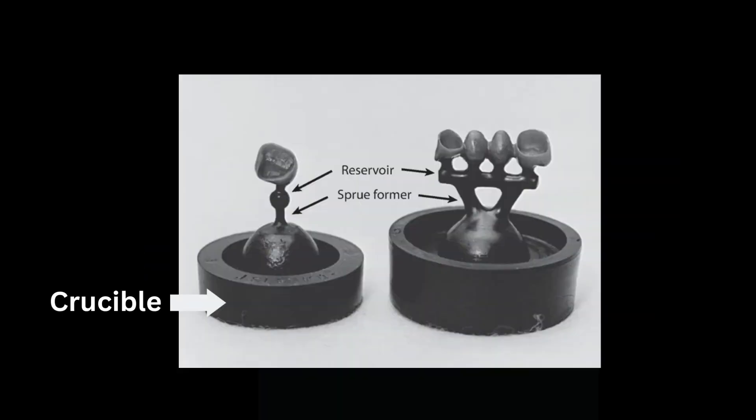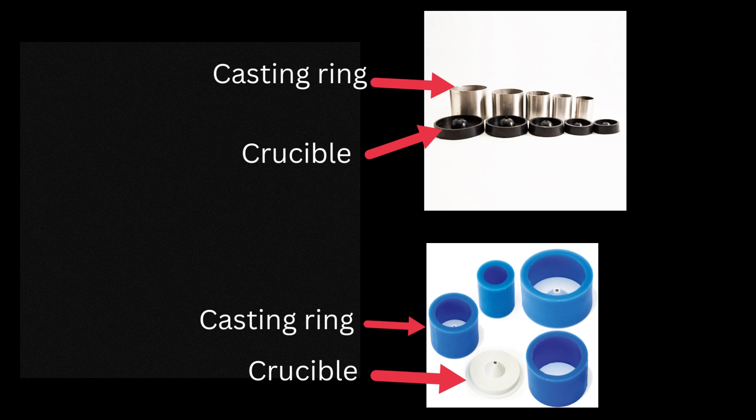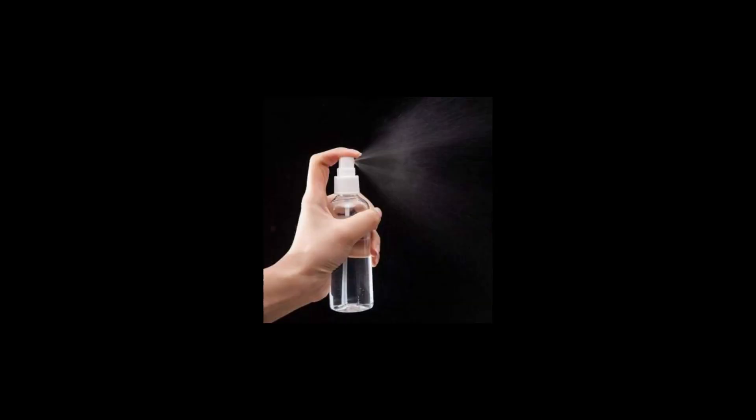The next step is to attach this wax pattern onto a crucible former, which is basically the base — it can be made of plastic or metal. After this, a casting ring is placed around it. A wetting agent is then sprayed onto the wax pattern; it reduces the surface tension and helps the investment adhere better to the wax pattern, and also prevents air bubbles.